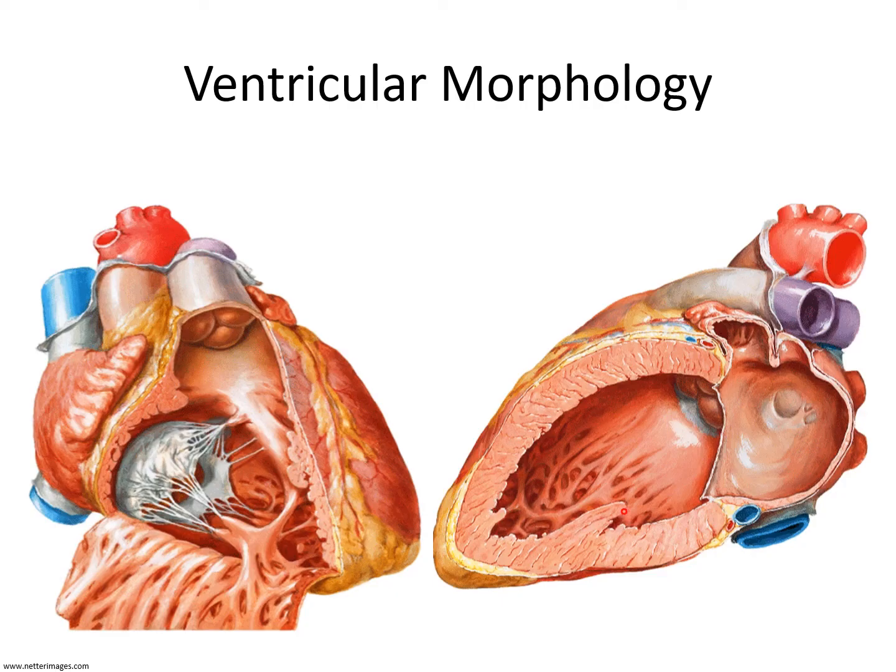We have two distinct papillary muscles that are situated along the free wall of the left ventricle, and the mitral valve here is a two-leaflet valve that is in fibrous continuity with the semilunar valve, which is the aortic valve in this case. And so those are the features that make the ventricles unique in their own and identifiable on the fetal echo by just looking at the features in your four-chamber view.